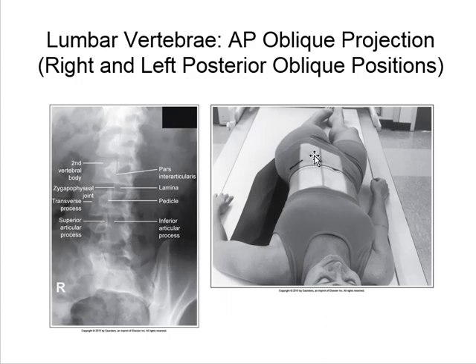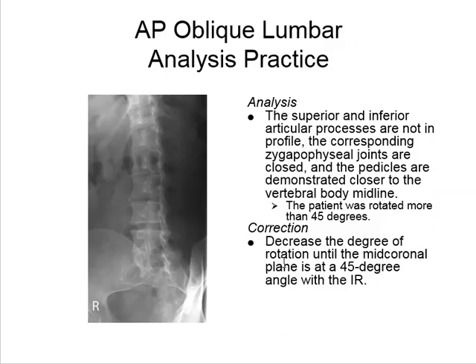So where you can position is just medial to the ASIS, which would be right about there. You can feel for the angle of the ribs right there. But on the image, what you see here is the ASIS. So if you feel for the ASIS and go medial to that, you should wind up pretty much right on the vertebra itself.